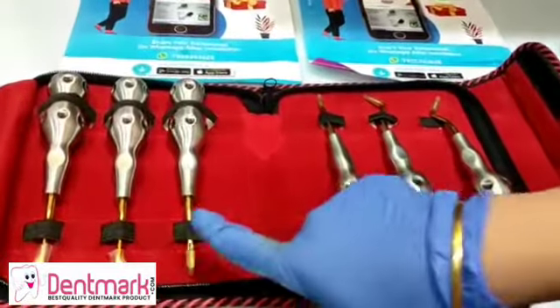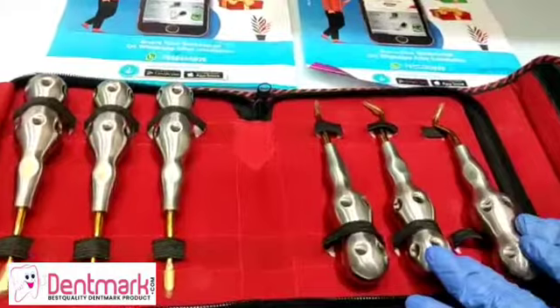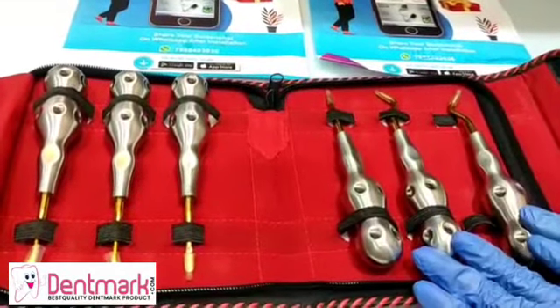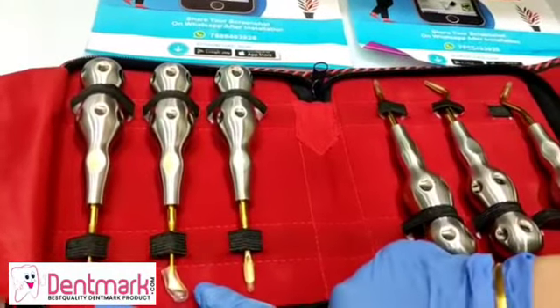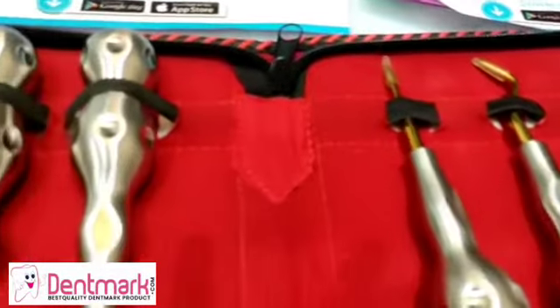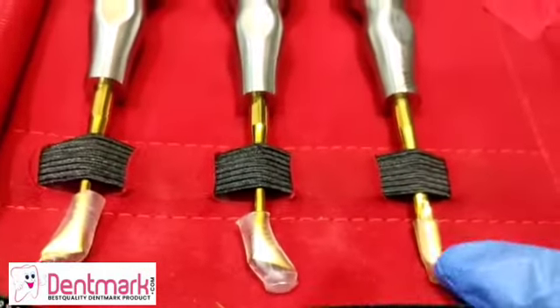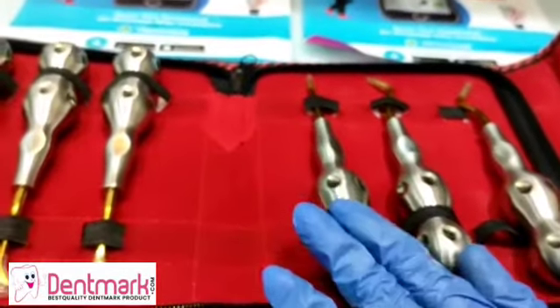These two are straight type dental elevators, these two are pickup type which are used to remove roots, and these two are triangular or pennant-shaped. All are root elevators used for separate functioning, and all of them come in pairs — a left and a right.